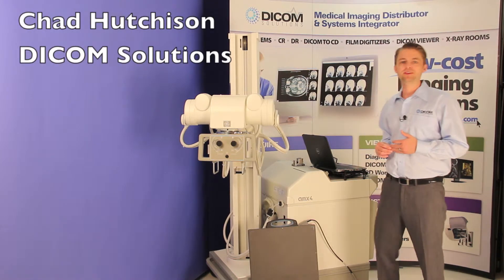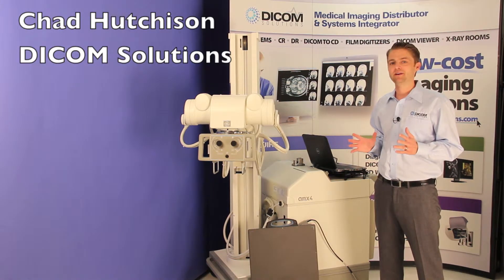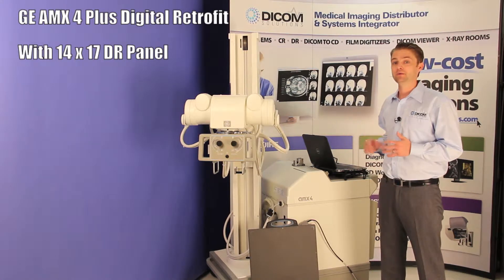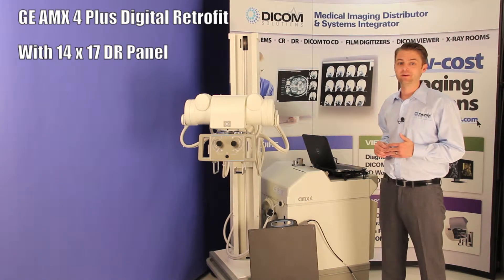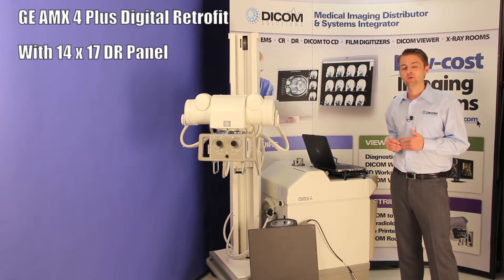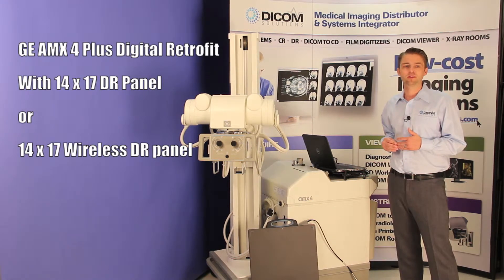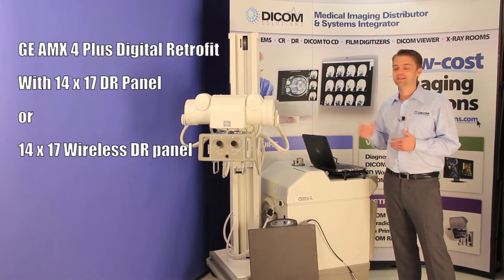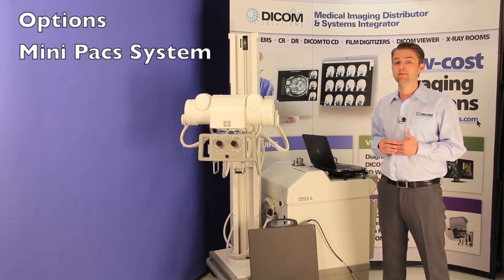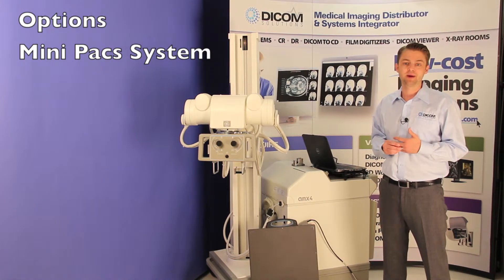Hi, my name is Chad Hutchison and I'm with Dicom Solutions. Today I'm going to introduce to you the AMX4 portable x-ray system with a complete retrofit and a DR panel. The DR panel you see here is a tethered DR option. We do have another option available with a wireless detector. The DR system here will also come with the option of either a mini PACS system, or if you don't need the mini PACS because your facility already has one, we can not include that into the package.